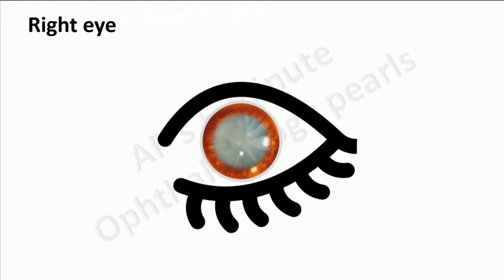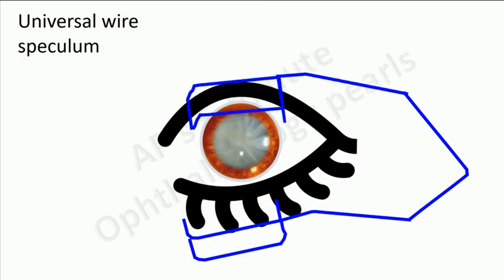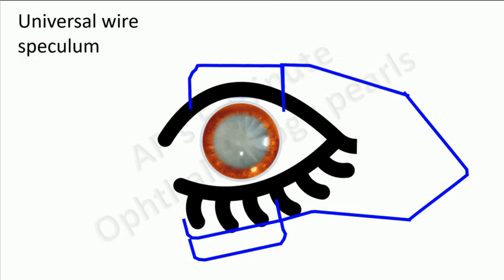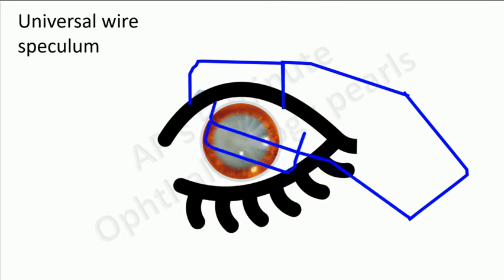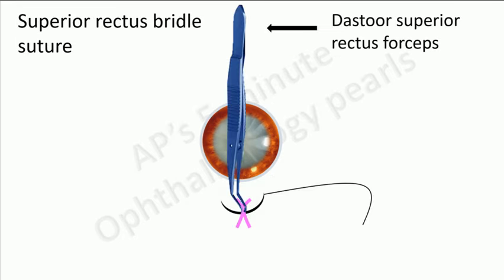Since the surgeon operates from the head end of the patient, this is the superior aspect and this is the inferior aspect. After anesthesia and prepping, a universal wire speculum is inserted to keep the eyelids apart to allow easy exposure for the surgery. It is called universal because it may be used for both the right and the left eyes. Here a superior surgical approach is demonstrated.